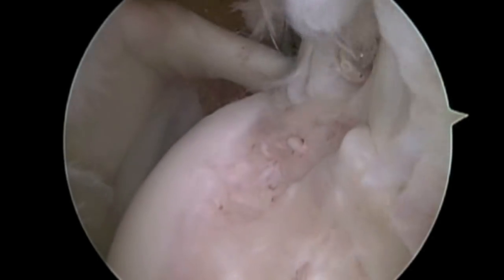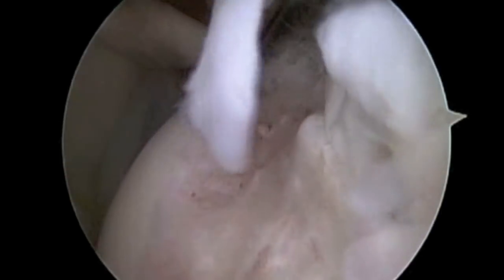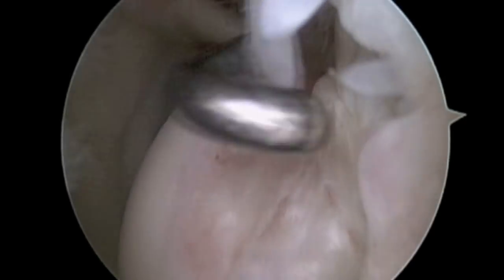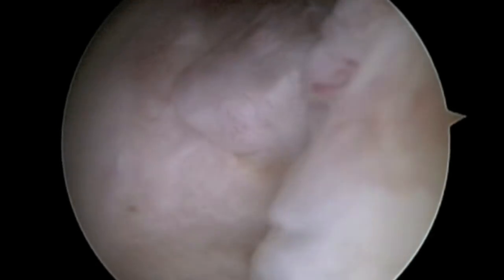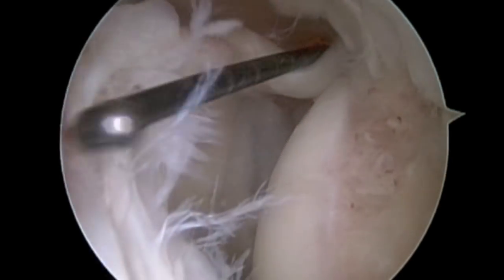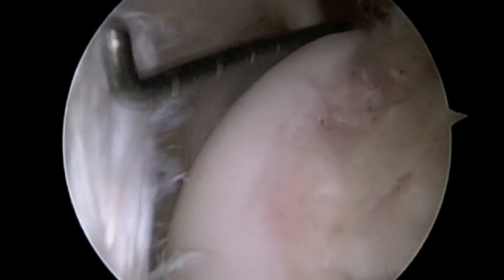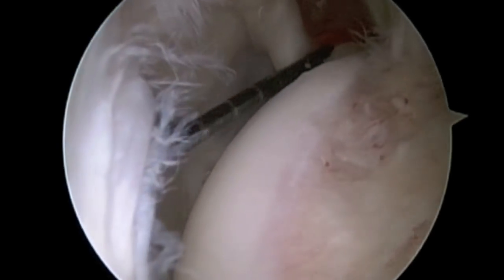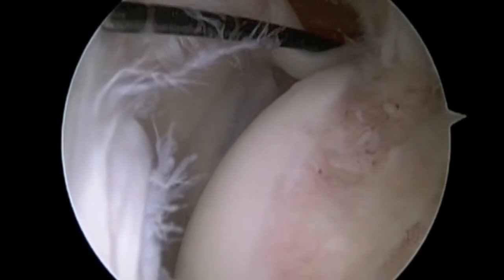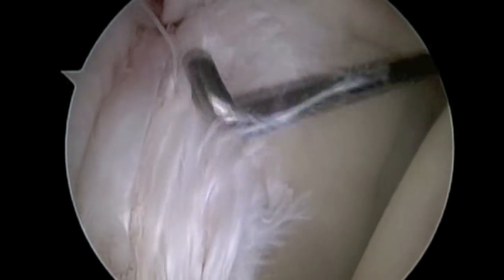This is a view of a right shoulder from behind. The probe shows a partial tear of the rotator cuff. A partial tear of the rotator cuff in combination with a tear of the labrum in the back and top portion of the socket, as is seen here, is termed internal impingement and is often found in pitcher's shoulders.